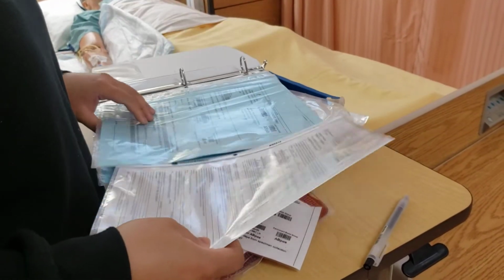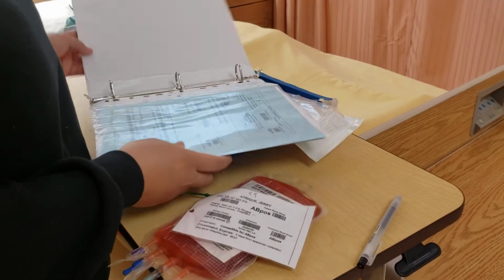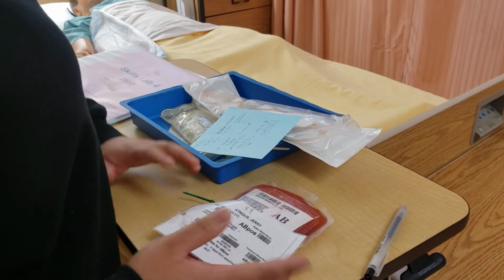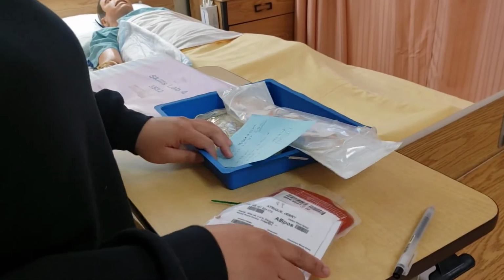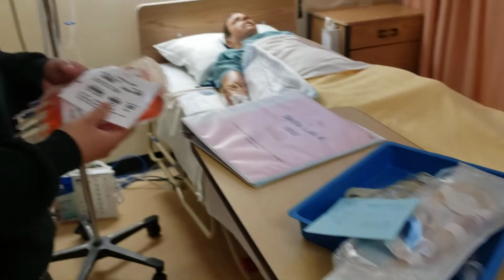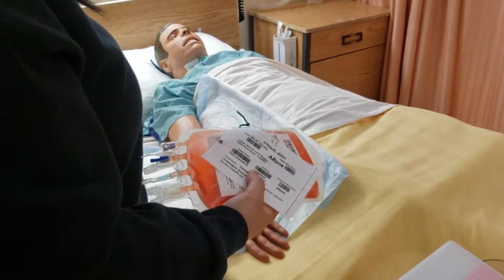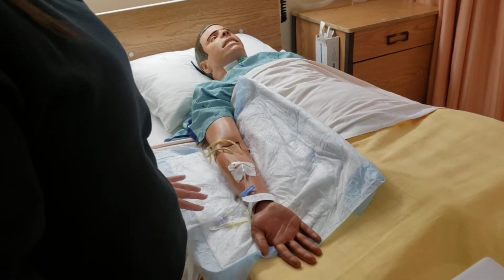So then we are going to do our fourth check. So we'll do hand hygiene, and then we will enter our patient's room with our second nurse, and then we will introduce ourselves. Hi, Jerry. My name is Alex Cruz. I'm a year 3 student nurse at the University of Manitoba.